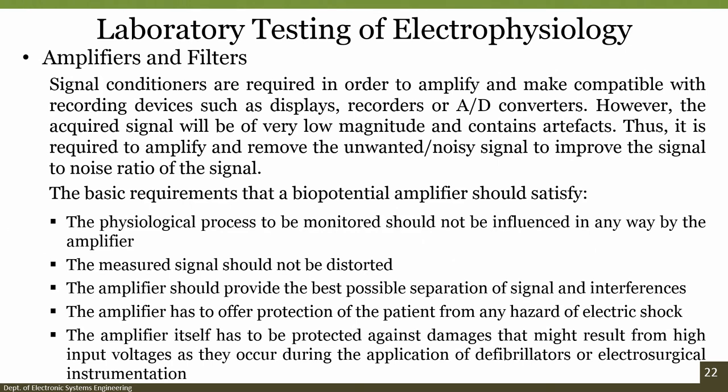Those are that the measured signal should not be distorted, the amplifier should provide the best possible separation of signal and interferences, the amplifier has to offer protection of the patient from the hazard of electric shock, and the amplifier itself has to be protected against the damages that might result from high input voltages as they occur during the application of defibrillators or electrosurgical instrumentation. Also very important, the physiological process to be monitored should not be influenced in any way by the amplifier.